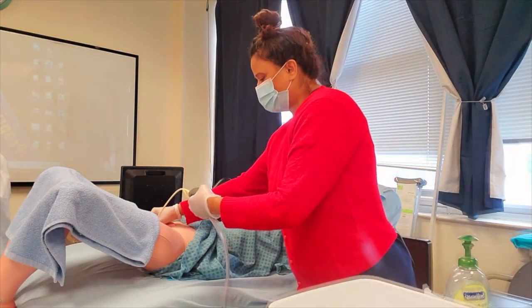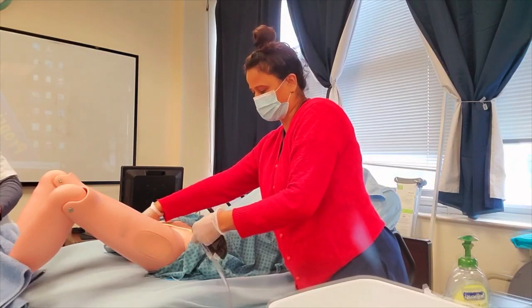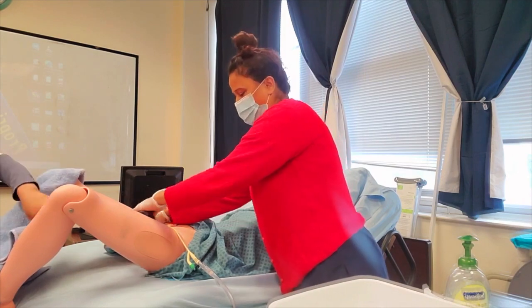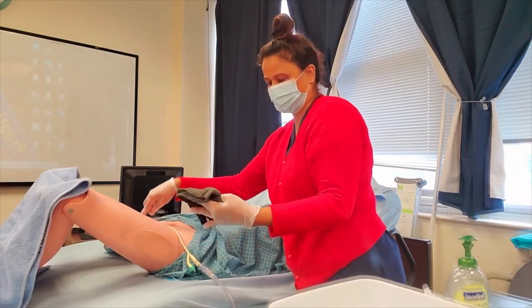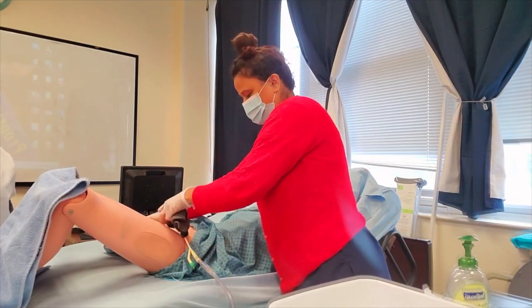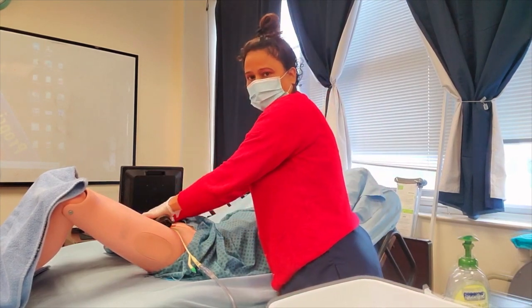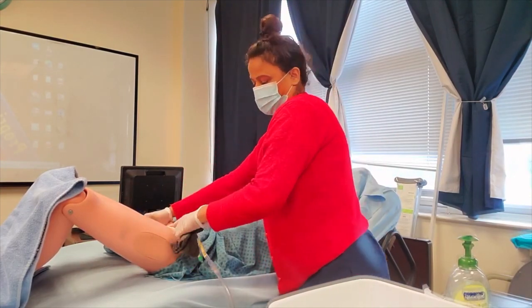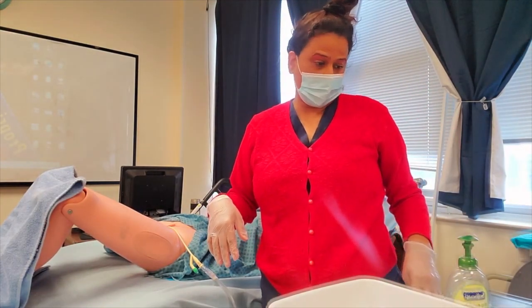Hold the catheter from the insertion side — right here is the insertion side. Hold it here securing it, and then wipe downward from four inches. This area is now contaminated. Fold that back, hold the insertion side, and continue: two, three, four.